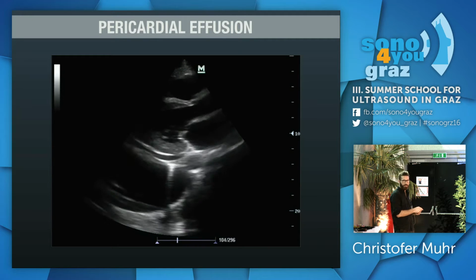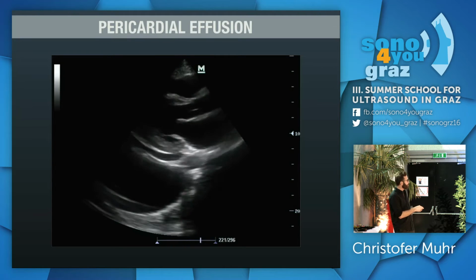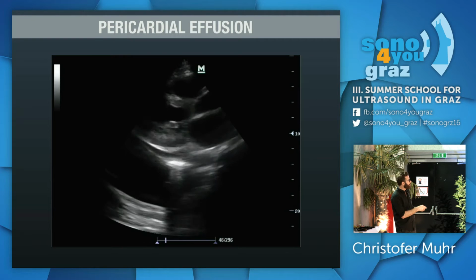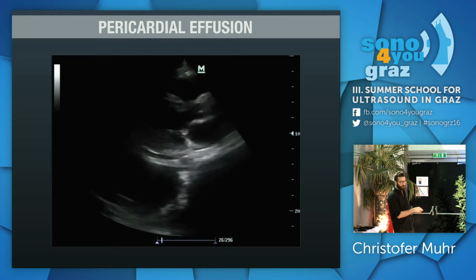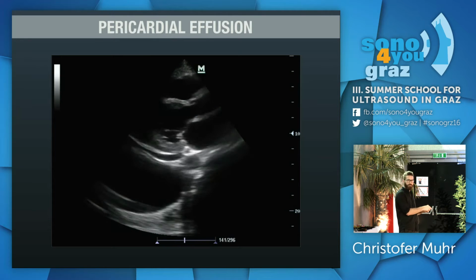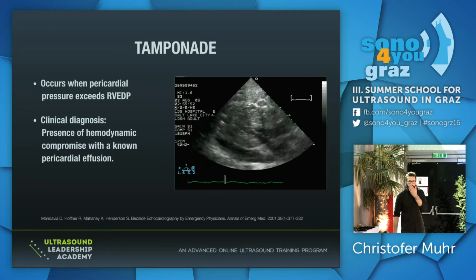This is pleural effusion, right? And this is pericardial effusion. Pericardial effusion is going to go underneath and sometimes sort of dislodge. What's this? Descending aorta, yeah. And of course, if you're not super strangely built, pleural effusion is going to respect the midline, right? Because this is left-sided pleural effusion, right? Okay? So that's a way to differ between those things. All right.